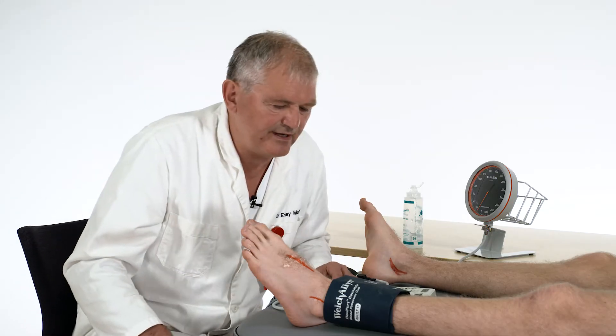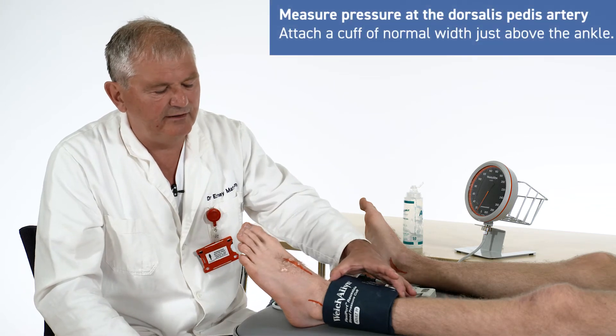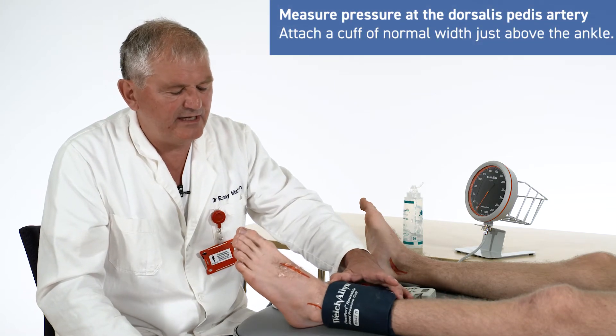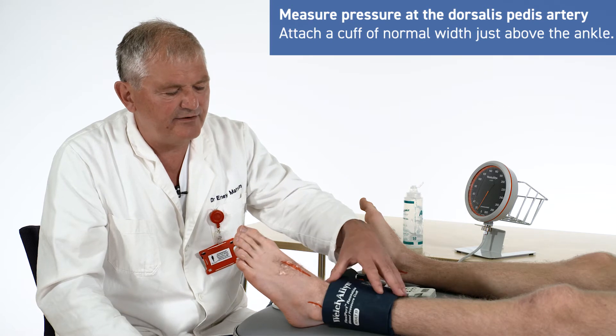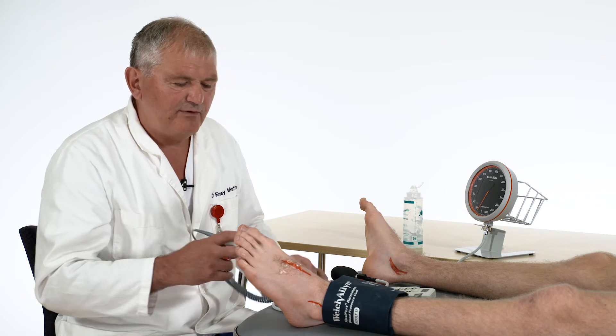We are now going to measure the ankle pressure and we are going to use a normal width manchette, because the reference values are all measured with this type of equipment.